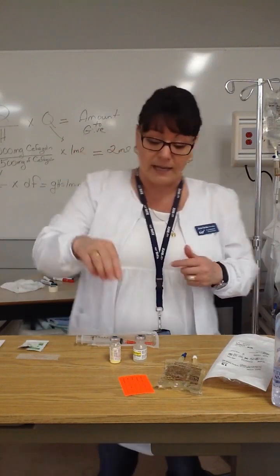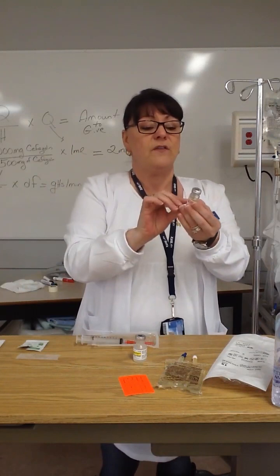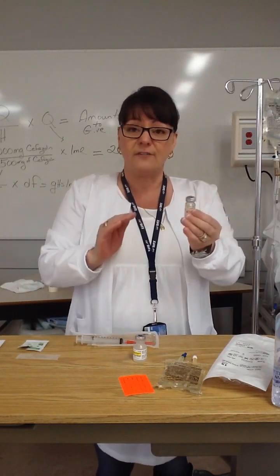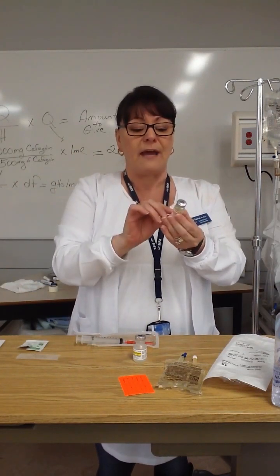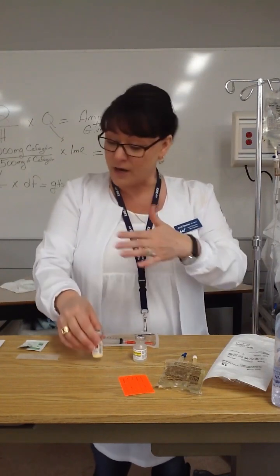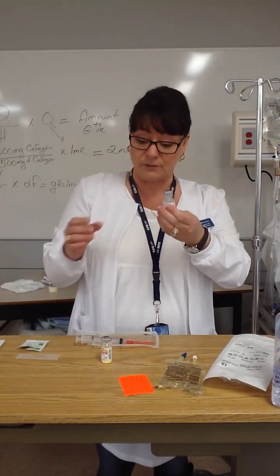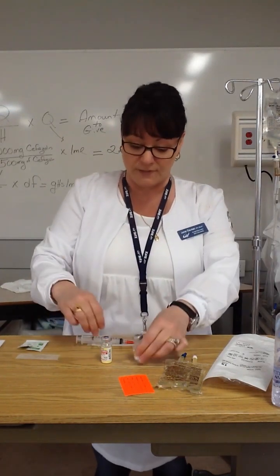And so let's talk about our math again for a second. And let's talk about our manufacturer's instructions. On the back of the vial, we know that in order to get a concentration of 500 milligrams per mil, we're going to add 5.5 mils of diluent. We know from our instructions that normal saline is an acceptable diluent. We have that here. We've swabbed the top.